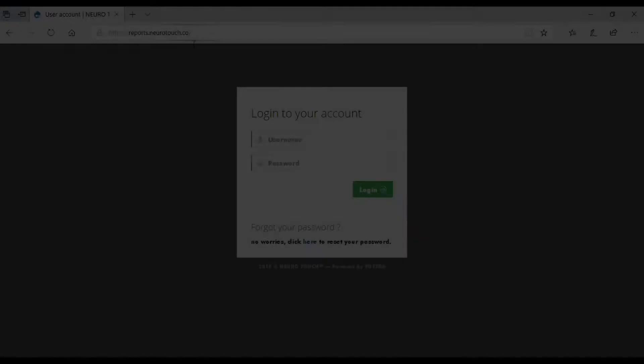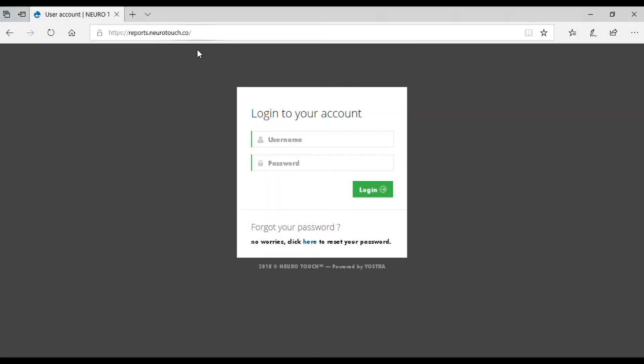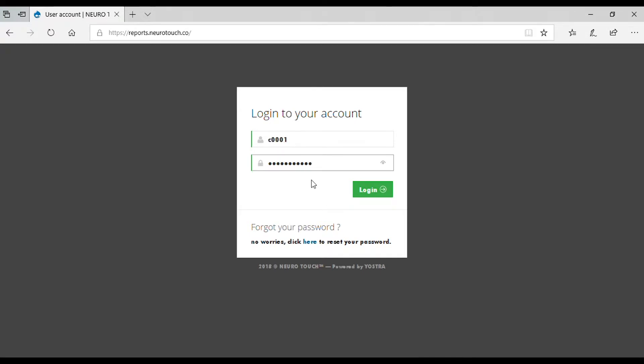Generating report. To generate a report, visit reports.neurotouch.co and enter your username and password.